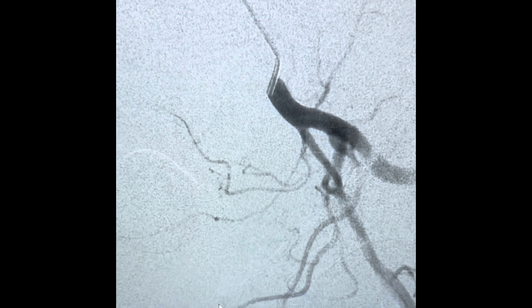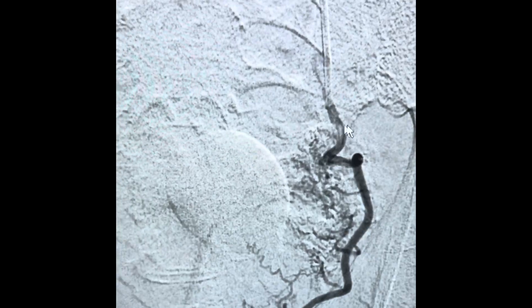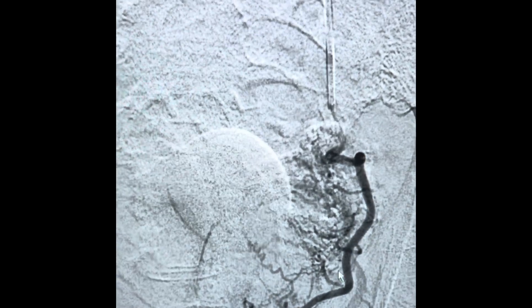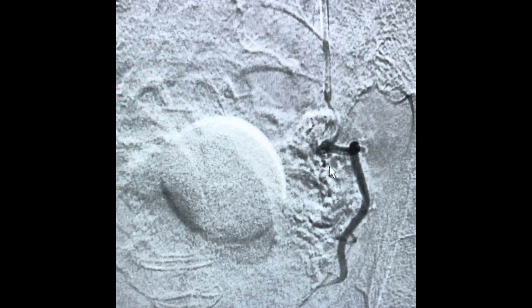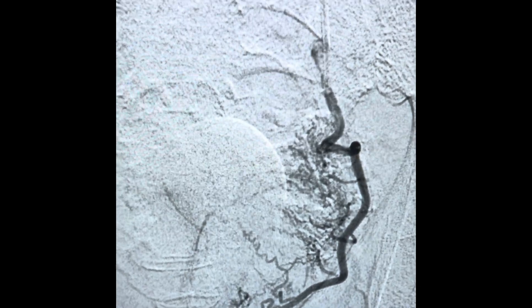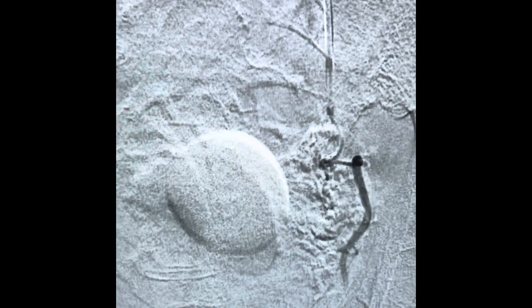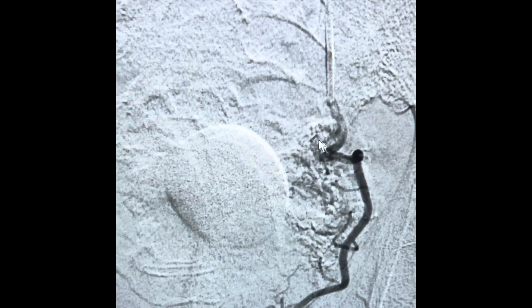It's this vessel that basically courses transverse along here and gives rise to all this prostatic tissue. We get a microcatheter into that prostatic artery, and you can see there are a lot of hypertrophied vessels — meaning large vessels supplying the prostate gland — which in this patient is about 260 grams, so this is a very large prostate.